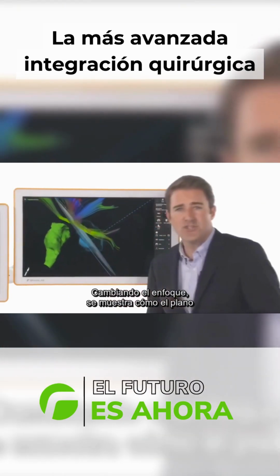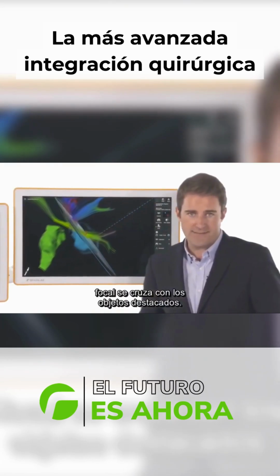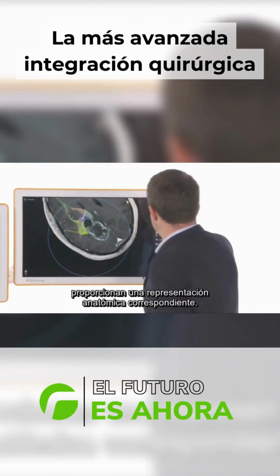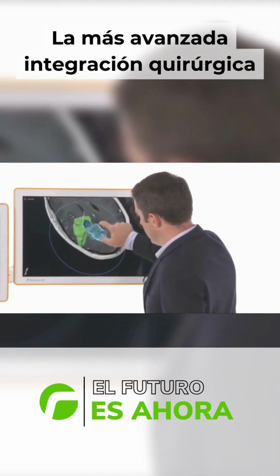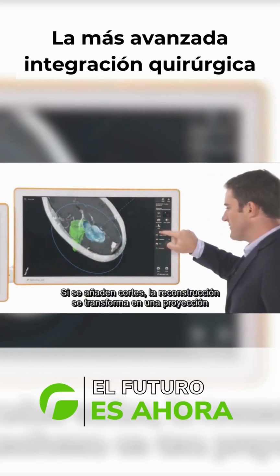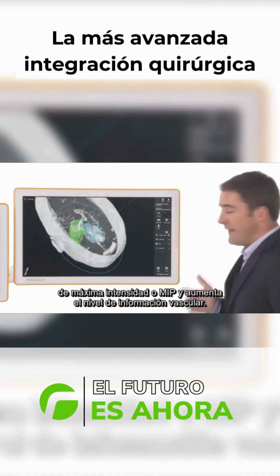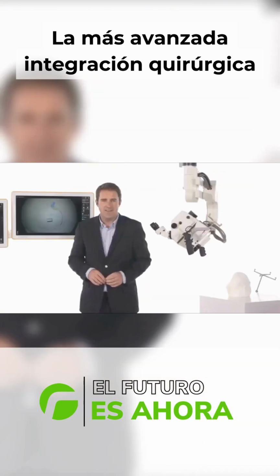Changing the focus shows how the focal plane intersects with underlying objects. Alternatively, the probe's eye MR image provides corresponding anatomical context. By adding slices, the reconstruction transforms into a maximum intensity projection, or MIP, and increases the level of vascular detail.